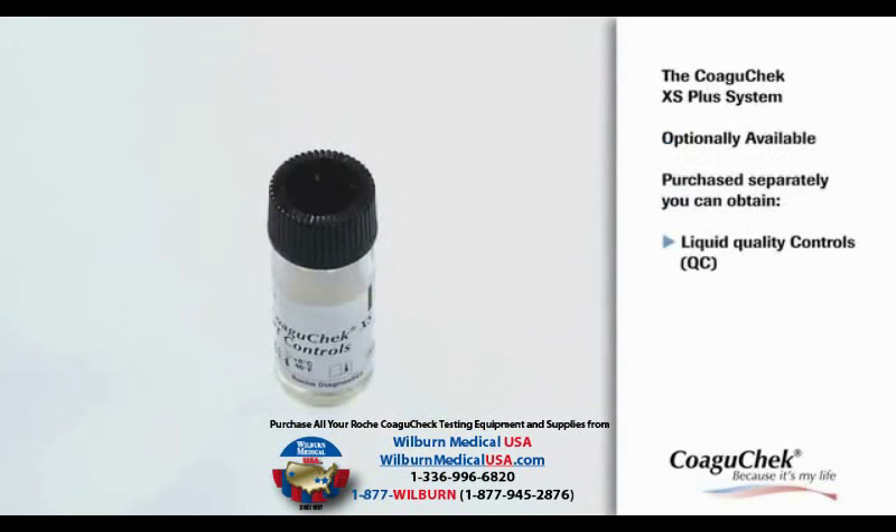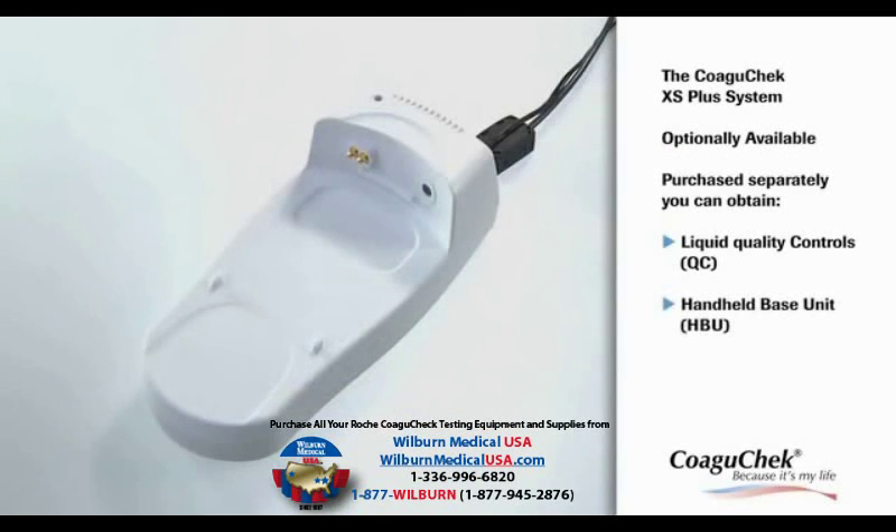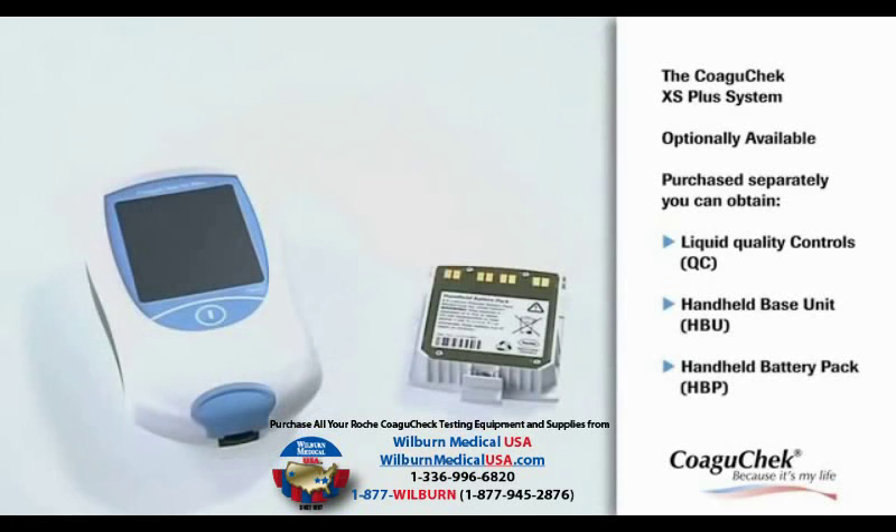You can use the optional Coagucheck XS PT controls with the meter in case your local regulations require liquid controls. The optional Handheld Base Unit provides connectivity to a data management system. Instead of batteries, the rechargeable Handheld Battery Pack can be used.